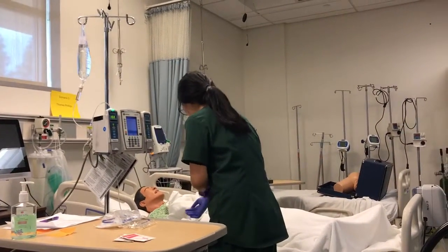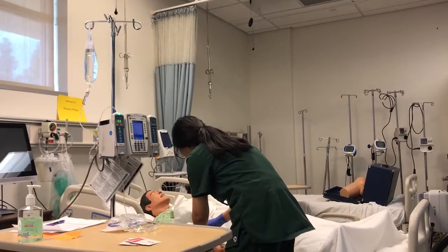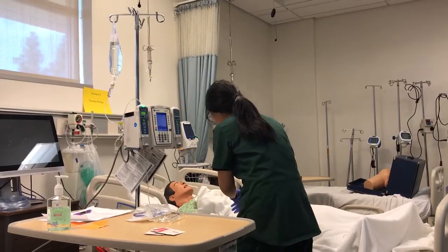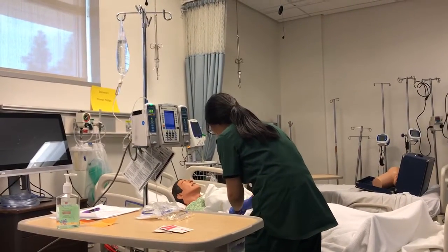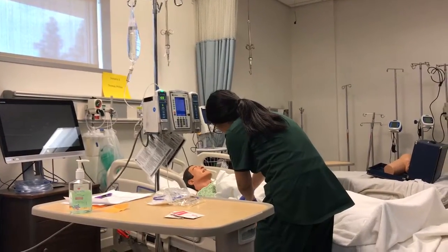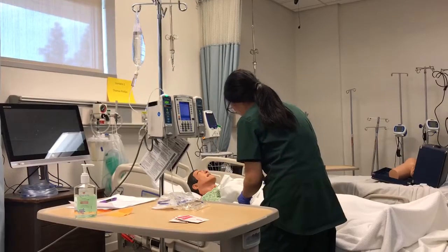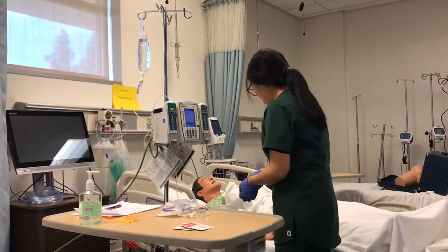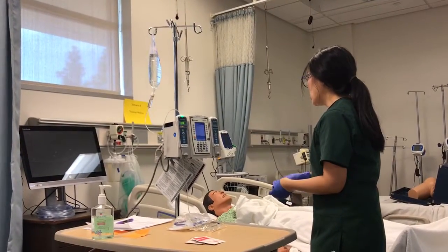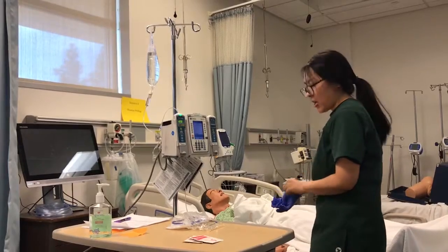Also, I will check the patient's IV site to see whether there is any edema, infiltration, or redness around this area. I will also ask the patient whether there is any pain around this area, and whether there is any allergy to cefazolin or any antibiotic. After I check all these, the patient is good. I also plan to tell the patient why he needs the antibiotic and what the side effects of this medication will be.